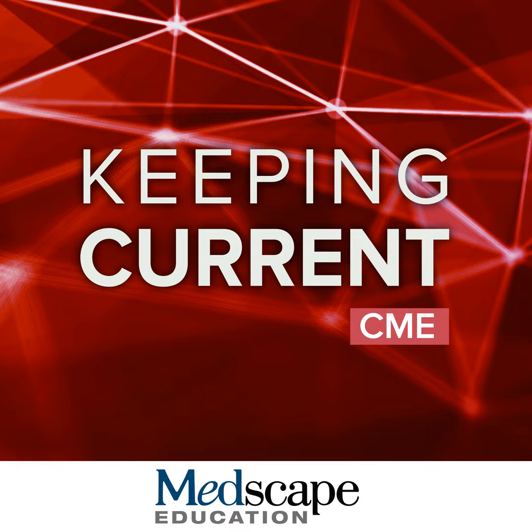There are also some interpretive pitfalls, particularly when we talk about hemangiomas. You can see here the same hemangioma imaged with gadoxetate versus extracellular contrast agent. Again, the first 2 minutes' appearance is very similar.